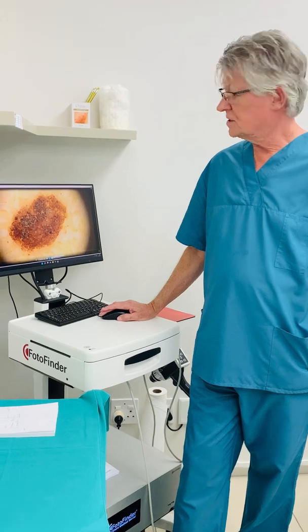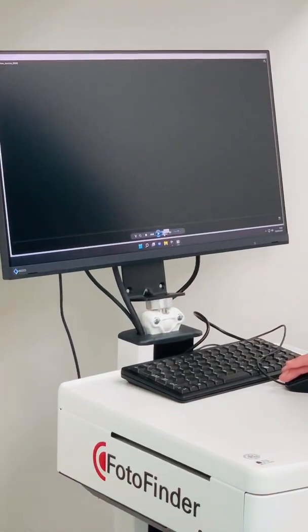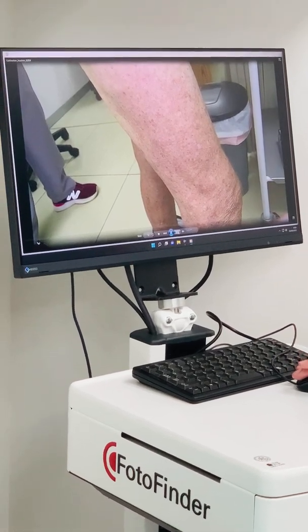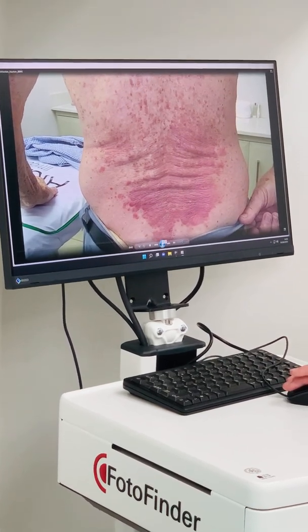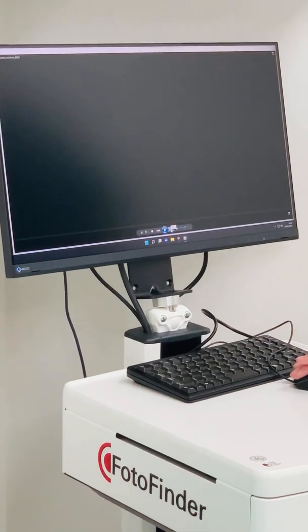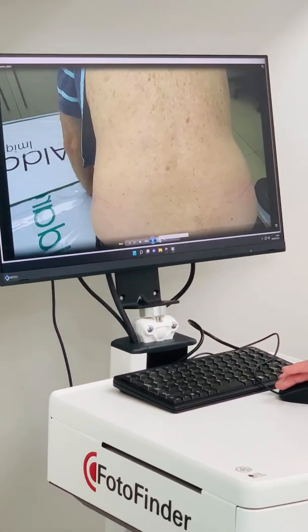I'll zoom in on the screen now so that I can show you a few of the ways that I've used this machine. To start with, this is a patient that I saw who had severe psoriasis. Now, in a case like this, it's good to have the before and after photographs for the patient's sake as well. Also, when you take photographs of this nature, you can motivate for biological treatments, which we did in his case. So there's his before, and let's just go back one, and after. I'll go back one. So the before and after, and it's nice for the patient to see how he's progressing.